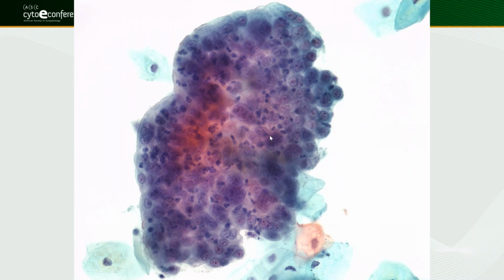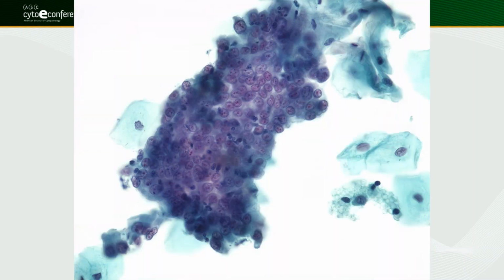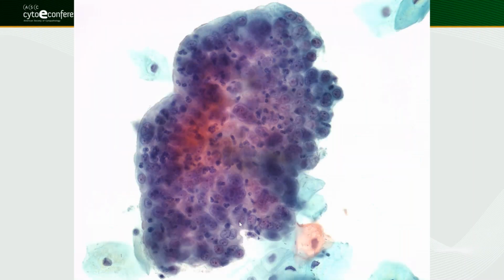Atypical endocervical cells should have more elongated and hyperchromatic nuclei. And this patient appears to have quite a bit of this large, more of a flat sheet. Although it's a little disorganized, it's overall a flat sheet. And whenever you see this group, always look at the periphery, and you see there are terminal bars and cilia, terminal bars and cilia.